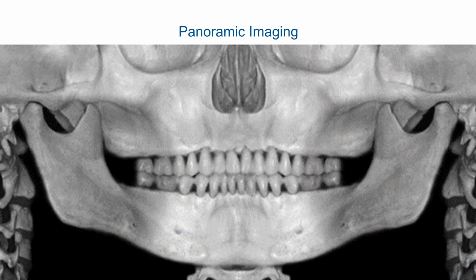And basically, that's an image that I like. It really demonstrates what a pan is exactly. It's like spreading the whole skull on a piece of paper. So you take a 3-dimension object, which is the cranium, and you spread it on a sheet of paper. That's why you will see that you have 2 spines and 2 hyoid bones. Everything that is located within the center of your cranium is going to be imaged twice. And that's the way that the panoramic works.